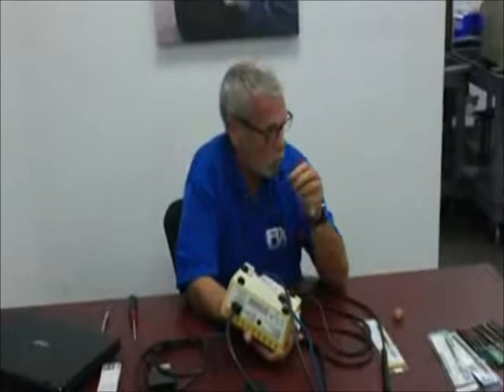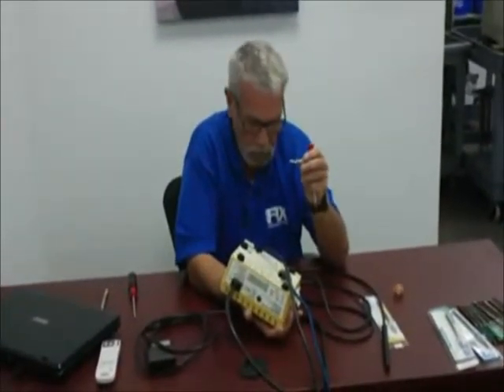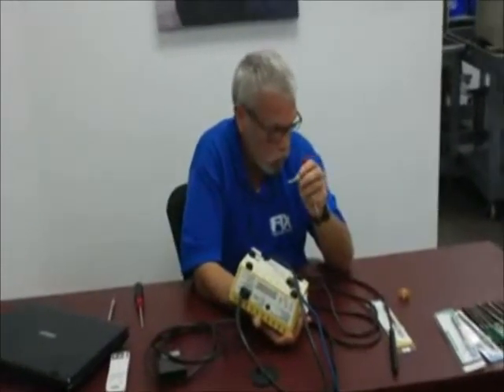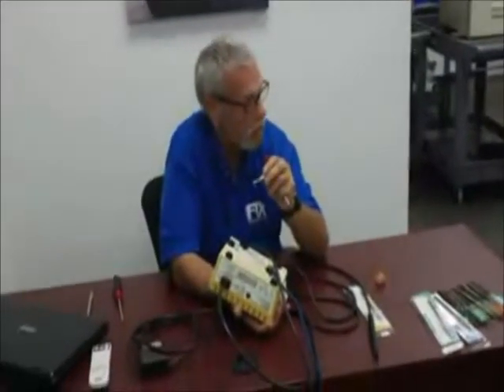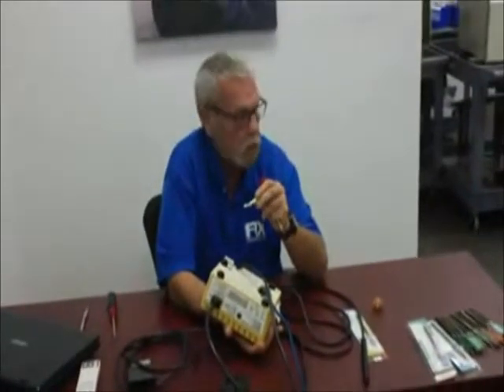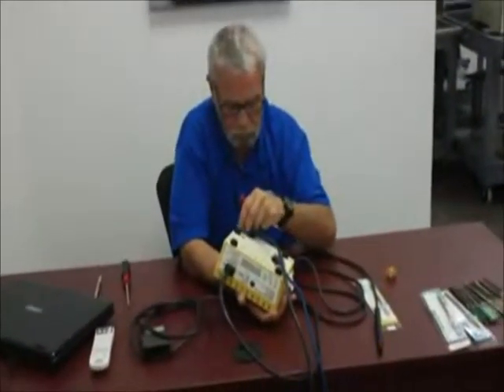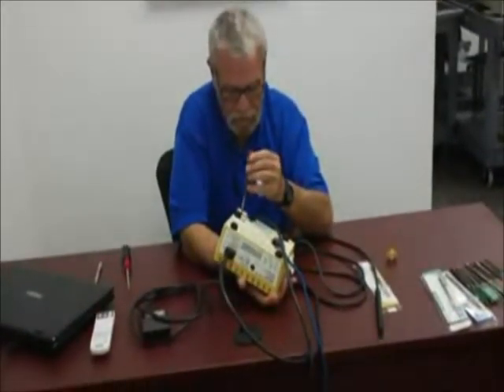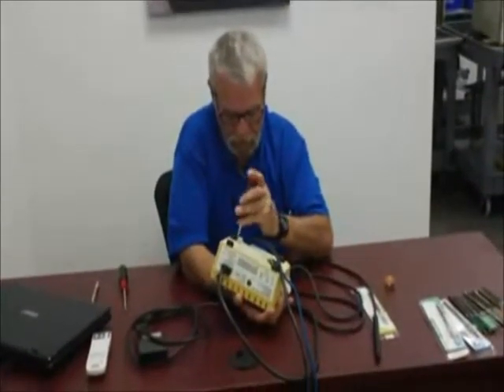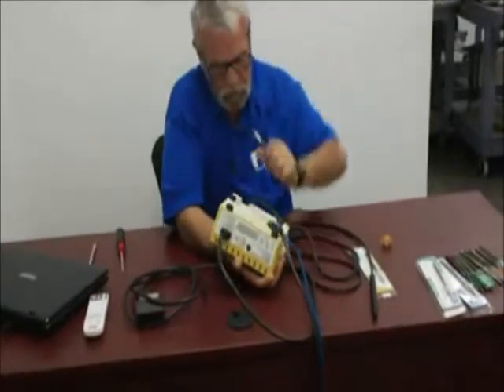The fuse nomenclature and specifications are plainly written on the machine. It takes a 1.25-amp slow blow fuse — slow blow being very important. There are two types of fuses: fast acting and slow blow. If you exceed 1.25 amps on this fuse, you risk burning the electronics and circuit boards in the machine. Better to blow the fuse than a $500 circuit board. We've restored our fuse back into the fuse holder.